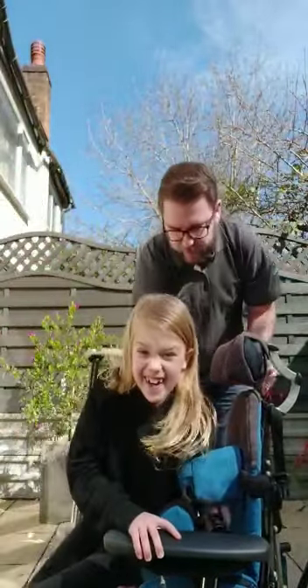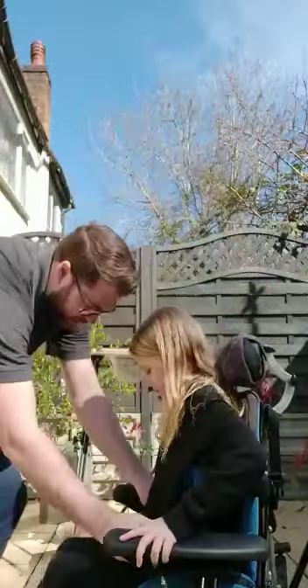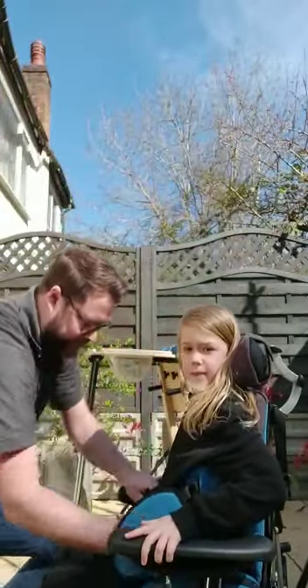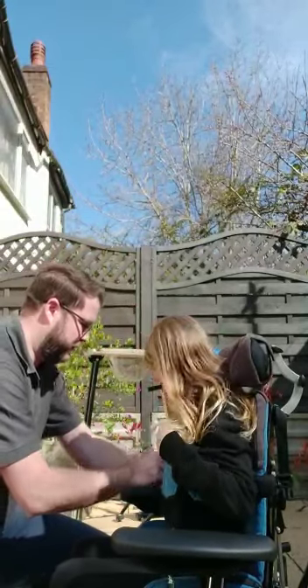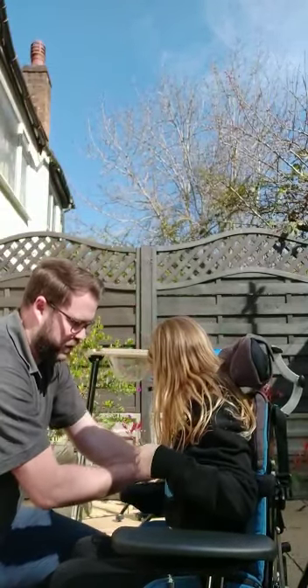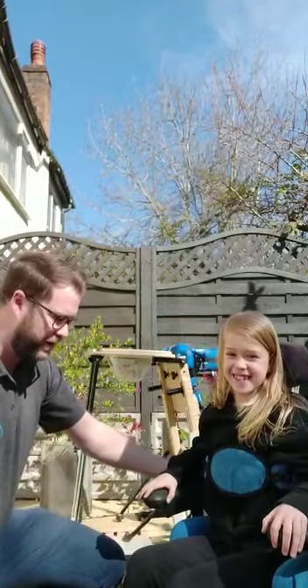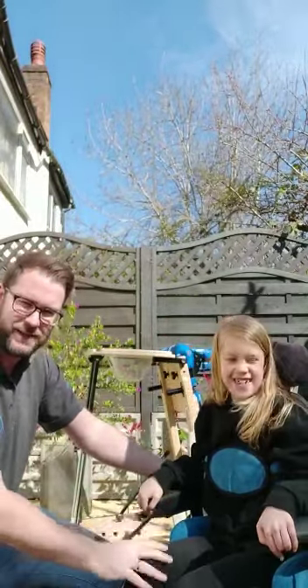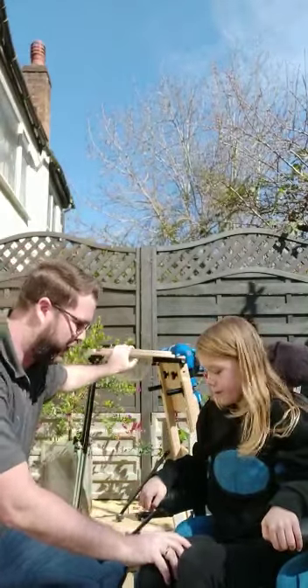There you go — stop posing in front of the camera. Lap strap on, and then we've got our chest pad. So this is Bella in one of our chairs in our EDS, and we're just going to show how to get from our chair into our standing frame behind us.